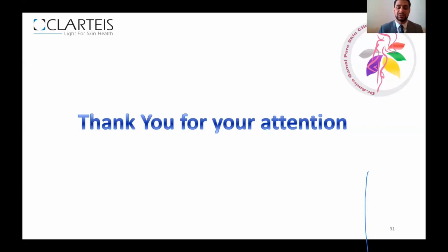Great. Another question was about the safety of Exciplex on the eyelid or genital area. It's very, very safe. I am using it a lot around the periocular area, eyelid and genital area, and it has a very fast response in these two areas. It's very safe. We don't have any complication with it because it's absorbed only superficially. The second thing, in these areas you adapt the dose according to our protocol; you will decrease it. In the eyelid, for me, I start with 80. Some doctors start with 50, but I start with 80. Don't worry, no side effects, nothing. I have a lot of patients with genital area hypopigmented patches or vitiligo, and they have a very good result without any side effects.